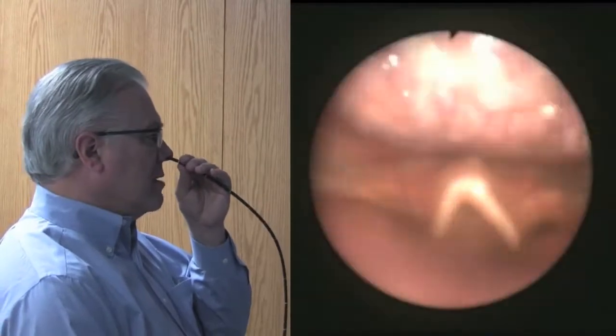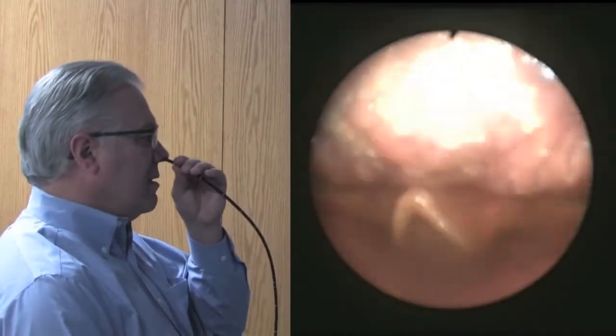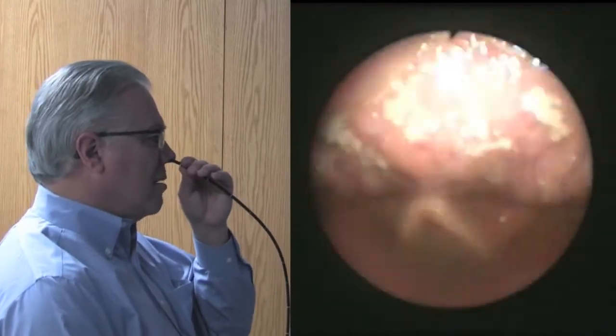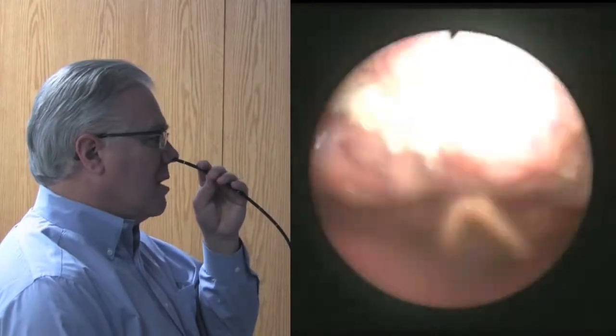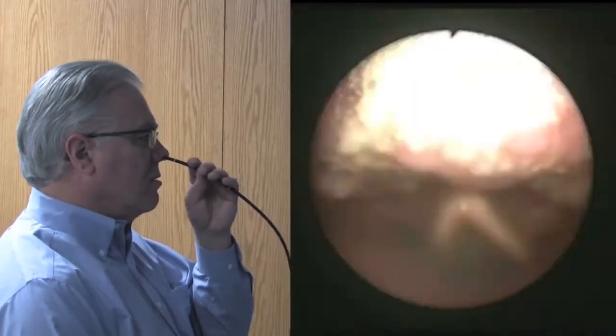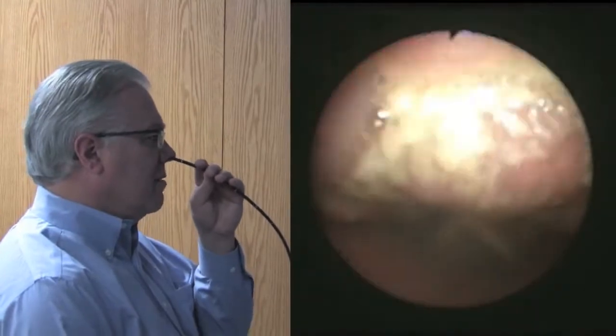In the front you can see the back of my tongue, and on the base of my tongue you can see that it's rather marbled in appearance, and that marbled appearance is the lingual tonsil. As I stop talking, you'll see a structure lay on the back of the tongue, and that's the uvula of my soft palate.